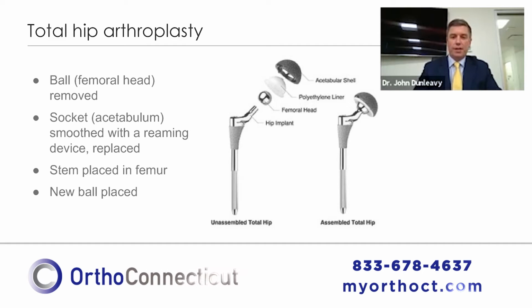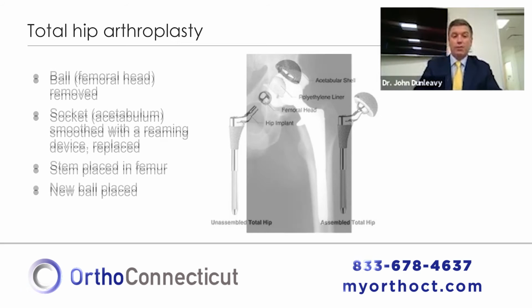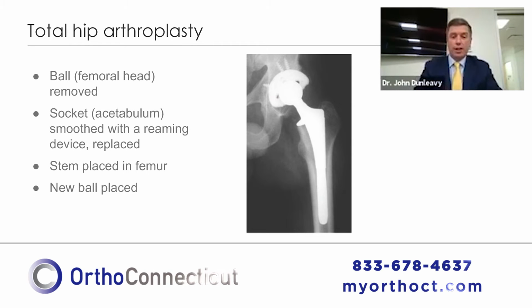So you'll see here what the implants look like. There's a metal stem that is inserted into the upper part of the thigh bone, which is called the femur. And there's a metal socket piece that's inserted into the opening in the pelvis, which is for the socket opening called the acetabulum. And then there's typically a piece of plastic that's placed inside that socket piece, and then that ball piece is either made out of usually metal or more commonly these days a ceramic substance. And when you put it all together and you take an x-ray, it looks sort of like that.